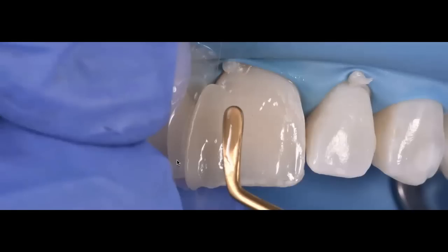This is the technique that I recommend using to build the line angles. This is what has been called the Mylar pull technique. You can see me here using a Mylar strip, a very long Mylar strip, adding the mesial line angle. This is only enamel.